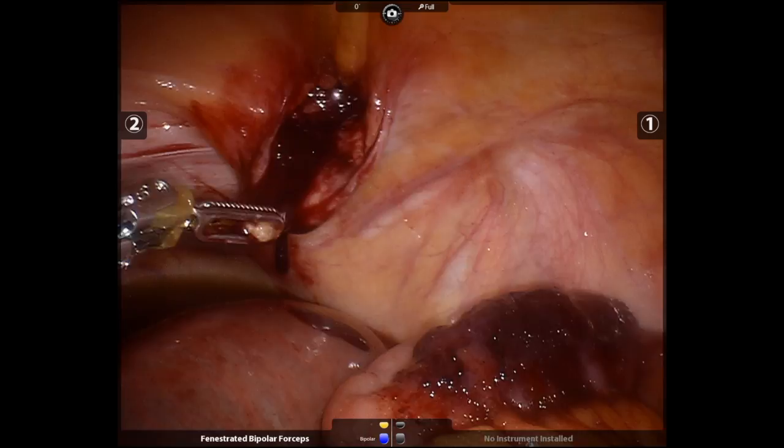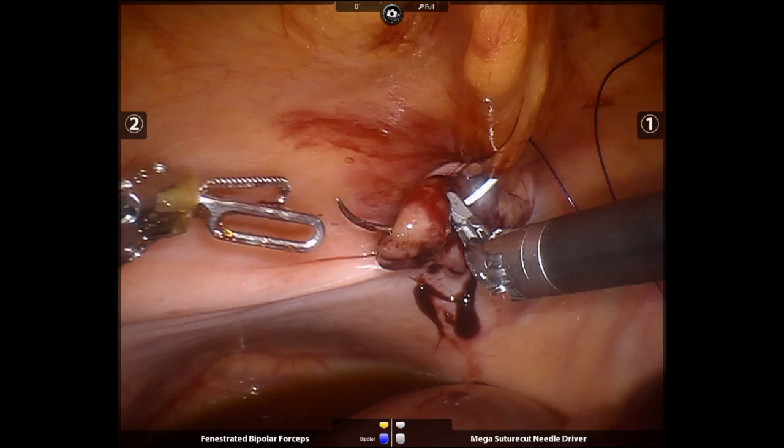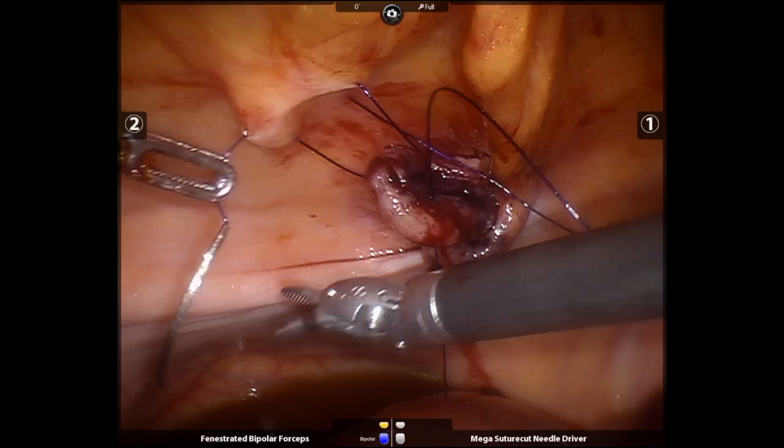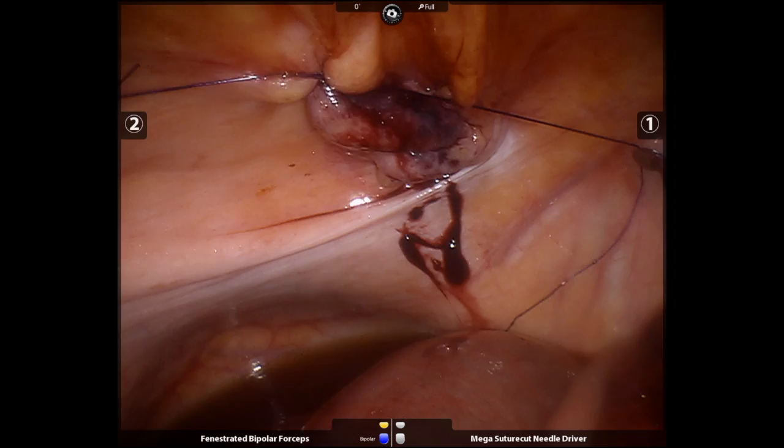A PDS suture is used, and I try to stay away from the future site of transabdominal preperitoneal dissection. His immediate post-op course was unremarkable, and the patient was discharged to a skilled nursing facility on post-op day 4.